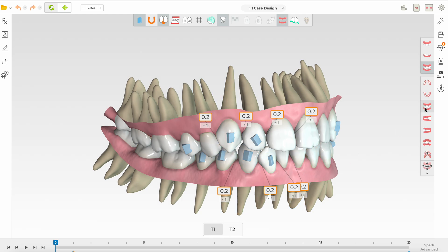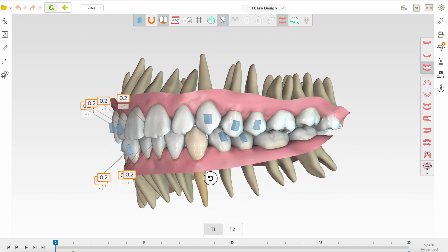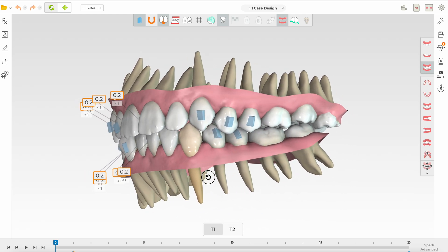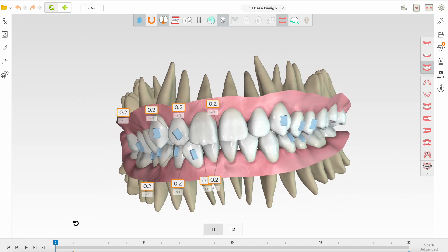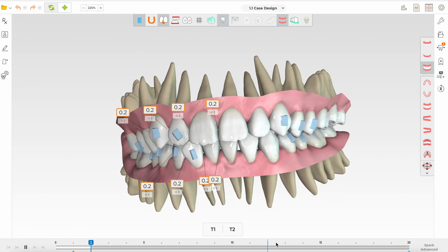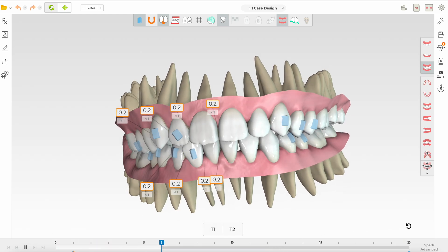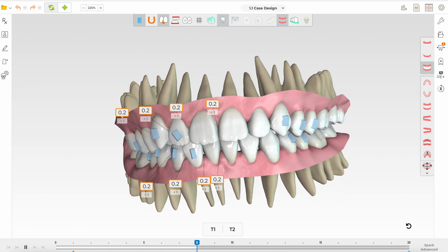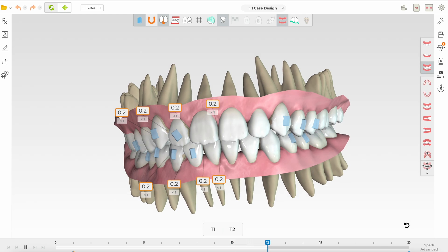So we know that cases like this, you don't want any labial movement really. You've got to restrict the labial movement. This was the original ClinCheck. I don't know what the dentist had told or what instructions were given, but they did try to limit the expansion.